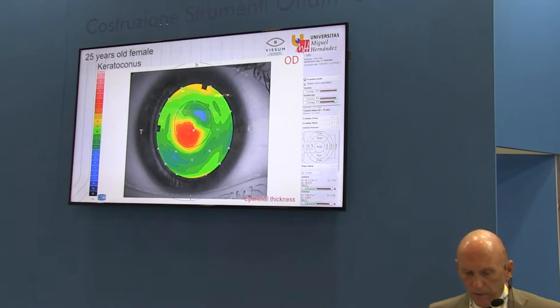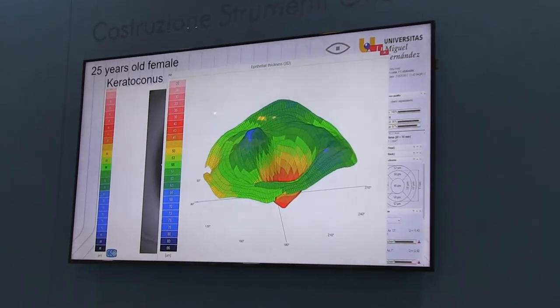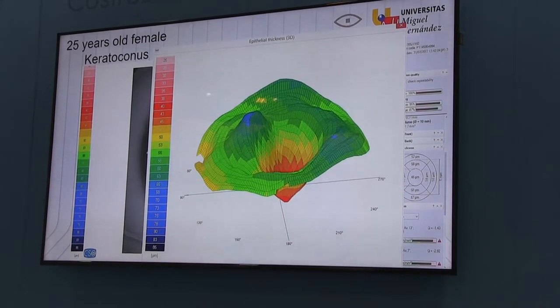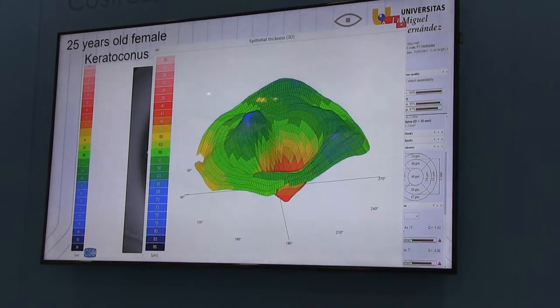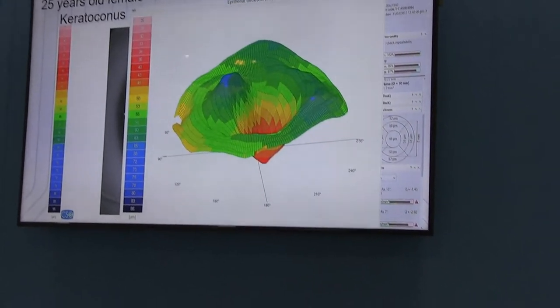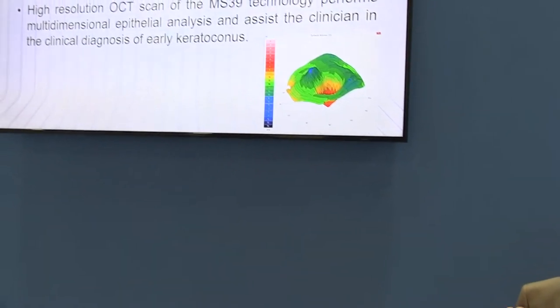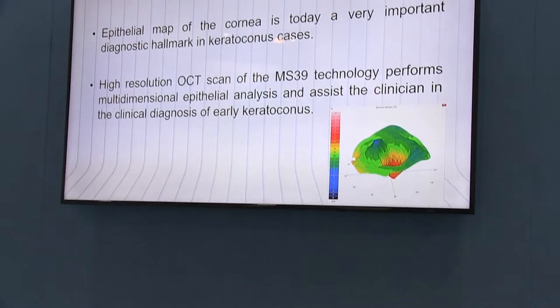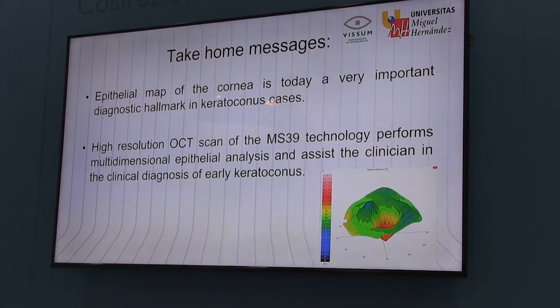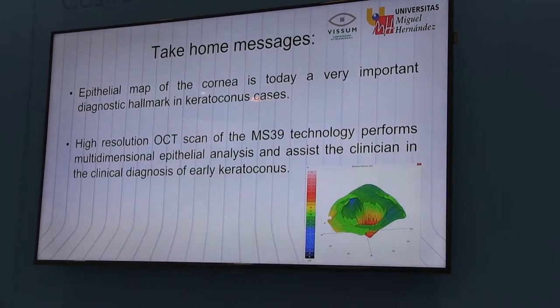25 years old, female, with keratoconus. This is the topography and the epithelial map distribution. The MS-39 gives you the opportunity to study the corneal epithelium. The study of the corneal epithelium is, for us, a keystone in the diagnosis of keratoconus and in understanding how keratoconus is making evolution. The epithelial map today is an extremely important hallmark in keratoconus cases for diagnostic purposes, and high-resolution OCT performs multidimensional epithelial analysis assisting the clinician in diagnostics of keratoconus.